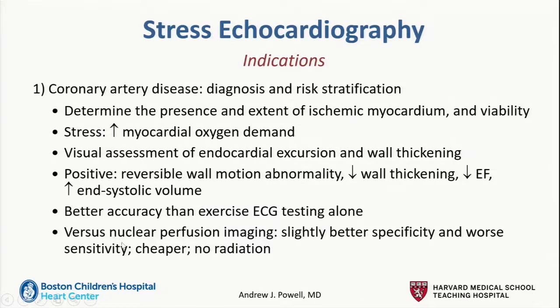And then just a general statement, if you compare stress echocardiography versus some of the nuclear perfusion techniques, stress echo tends to have slightly better specificity and worse sensitivity. It does have the advantage of being cheaper and doesn't have any ionizing radiation exposure compared to the nuclear options.